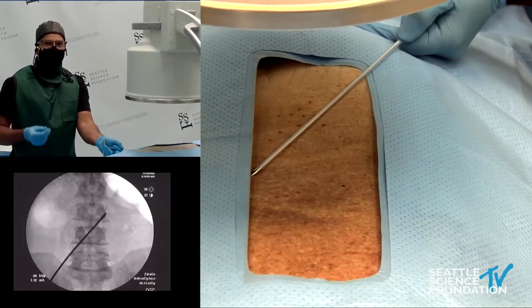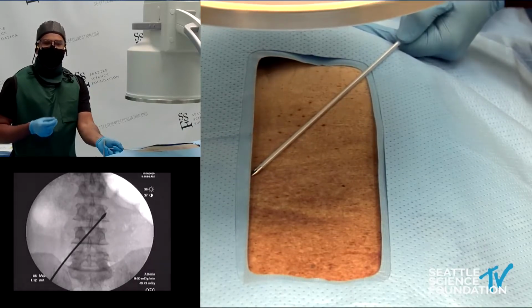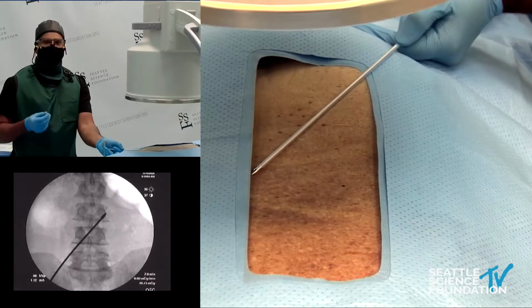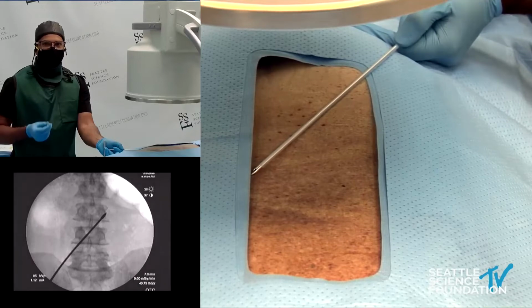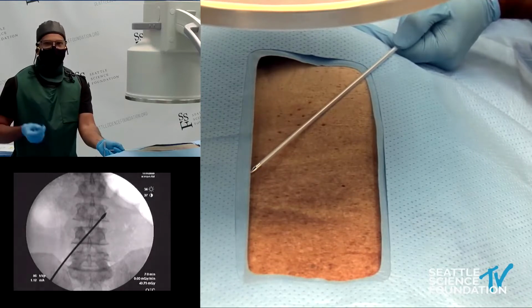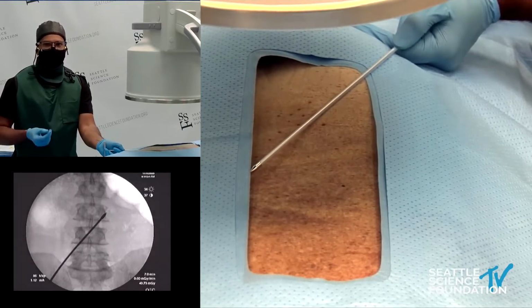Really start to mark and understand the patient's anatomy, fluoroanatomy or sonoanatomy, so you can make sure the procedure is done correctly. I think this is extremely important when it comes to DRG stimulation because, as you will see, the way the needle is entered, the changes in angulation of just 3 degrees can make a huge impact on how well you get that lead out of the neuroforamen or how well you can make the tension and relief loops. And you might spend 30 minutes just struggling when if you just made a small adjustment in the beginning, you would have saved all that time procedurally and all that fluoro exposure.